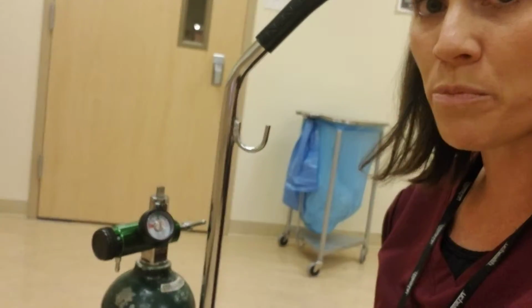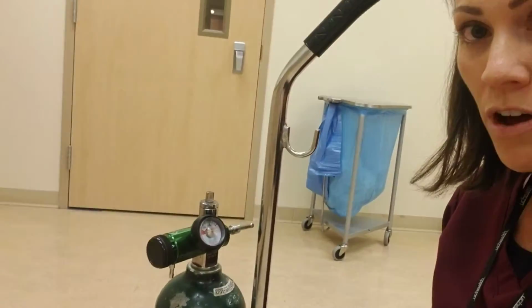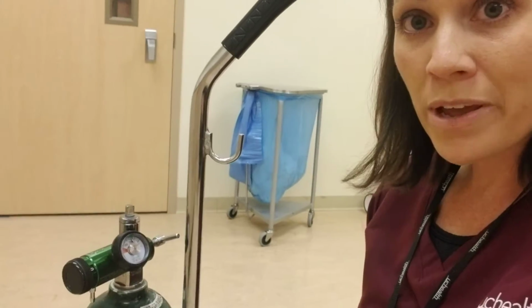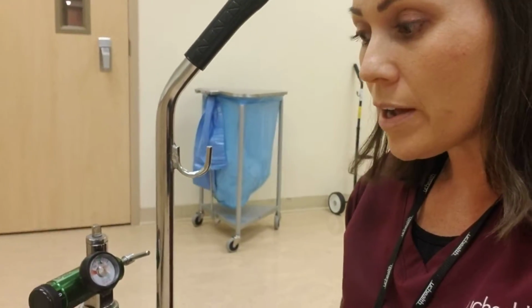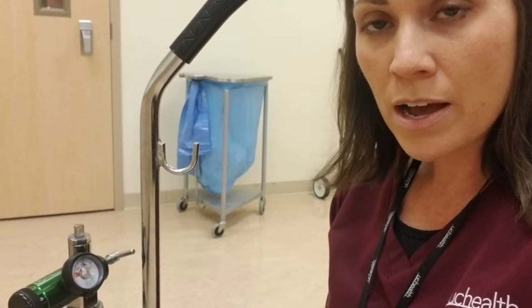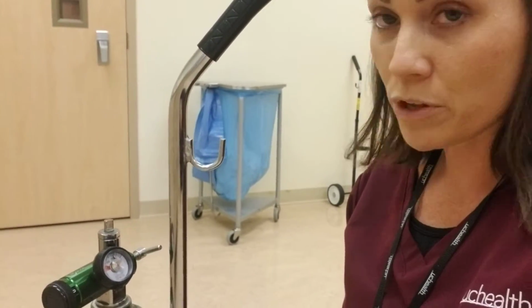What you want to do is get your pressure times the cylinder coefficient. This is an E tank of oxygen, so our cylinder coefficient would be 0.28. For our big H tanks, the cylinder coefficient would be 3.14. So you get the pressure times the cylinder coefficient, and we're going to divide that by the flow that you're using it. So your flow is at 2.